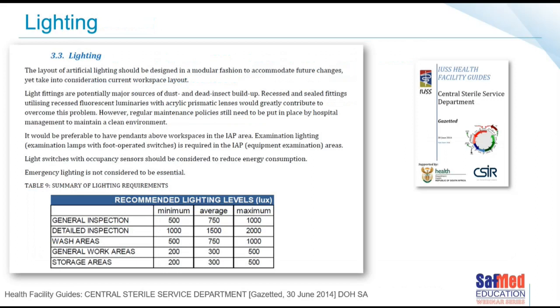Now, what about lighting? Another important concept, very, very important to us in the CSSD. Our guidelines clearly state that light fittings are potentially a major source of dust and dead insect buildup. One would hope there are no insects in our CSSDs or in our sterile store area at all, but we do know things happen. We do know doors need to open and close, and we know that flies and all sorts of things can get into our CSSDs and into our theatre complexes. And these are things that we need to manage.